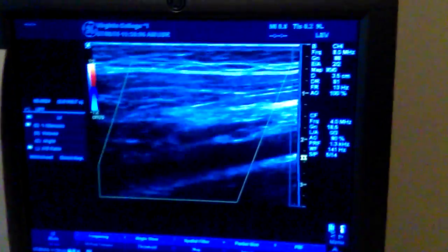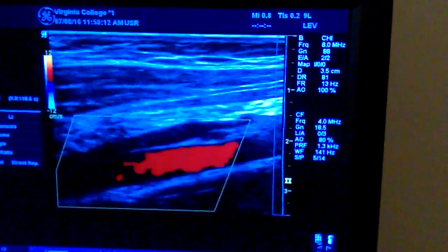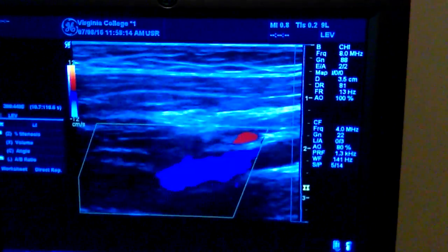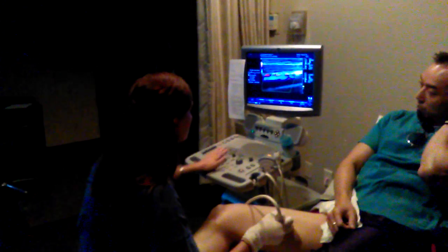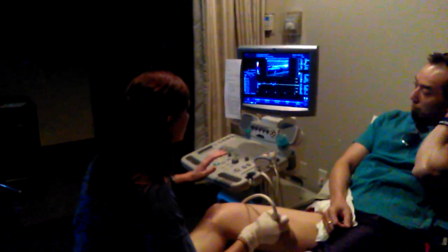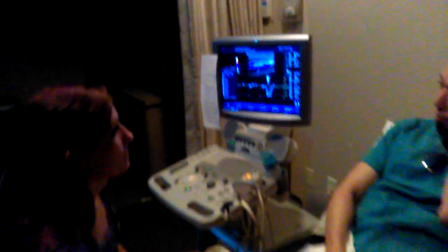So there we get our grayscale. And this is a smaller vessel, so bring our color box down some. Alright, and I'm about to augment, so I'm going to get comfortable, get my arm anchored to where it's not going to move if I augment. Okay. So that's it. See, this hand never even moved because I had it anchored. And so I could just come right over and squeeze, and none of this ever moves.